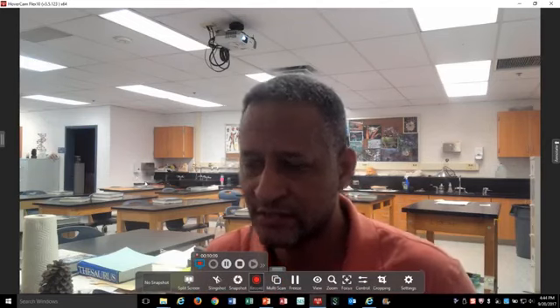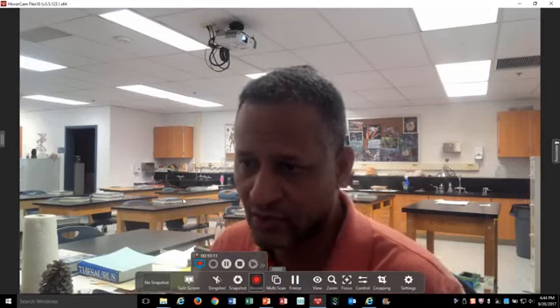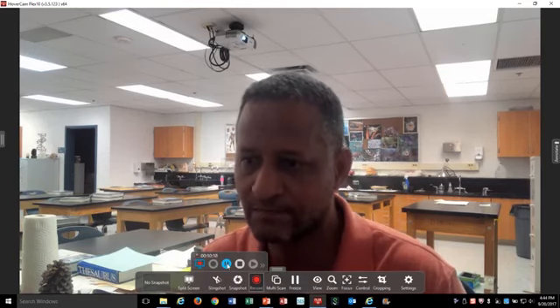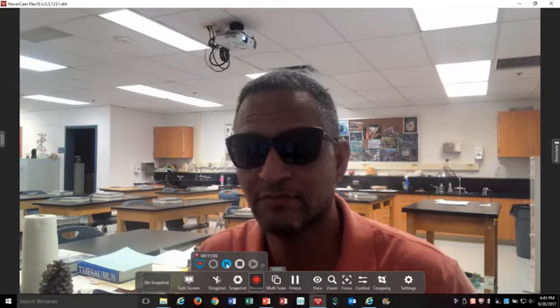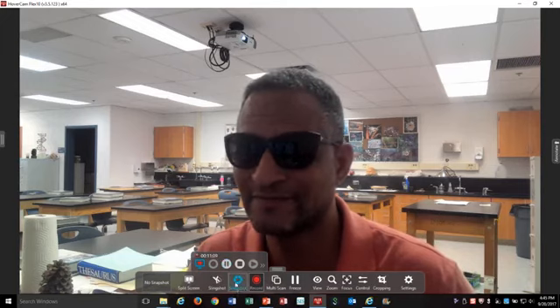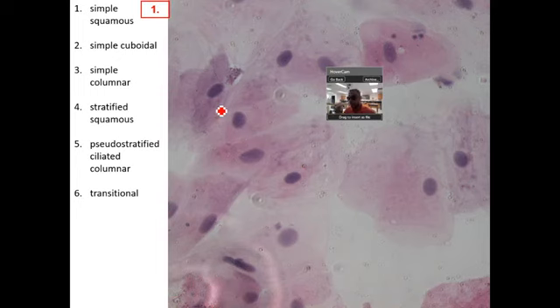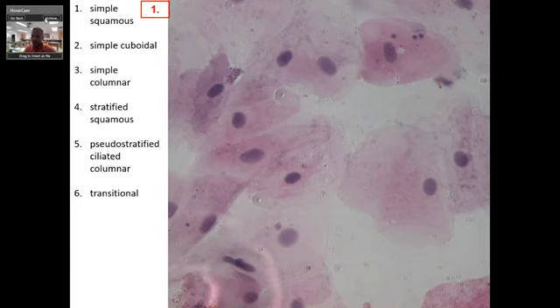All right, so let me go back, and this has been a good review, and what I'm going to do is just do 4 or 5 slides, and this time I'm just going to give you an answer choice. So let me just pause for a second. Are you ready for the speed round? Okay. Now, this time, what I'm going to do is throw myself out of the way here, and here's your list of the answers. By the way, if you're one of my students, you will not have a word bank.